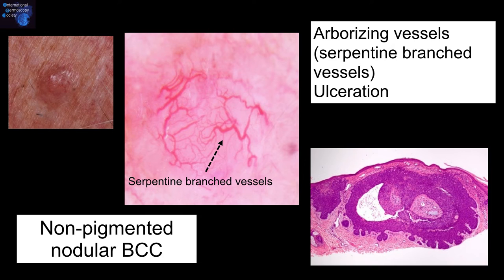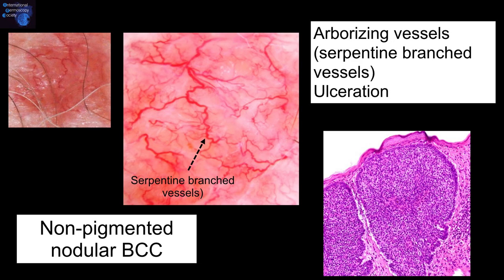Another example of a non-pigmented nodular basal cell carcinoma. For non-pigmented nodular basal cell carcinomas, the key feature is arborizing vessels — in this instance, these serpentine branch vessels. One more example showing a non-pigmented nodular basal cell carcinoma with the serpentine branch vessels.